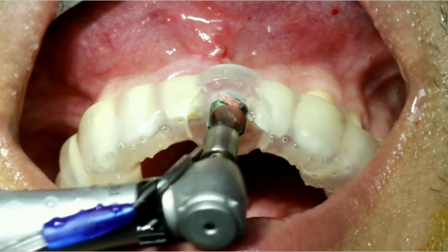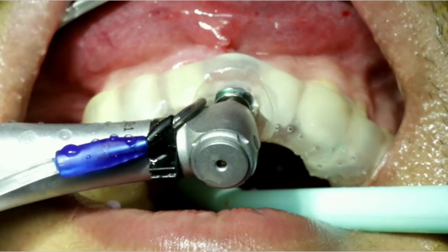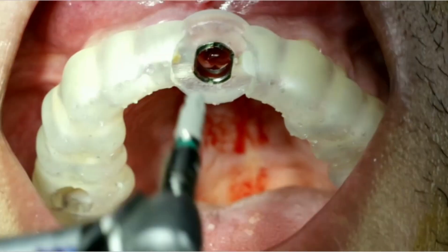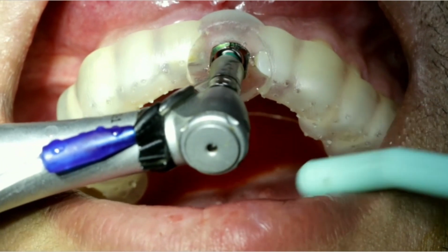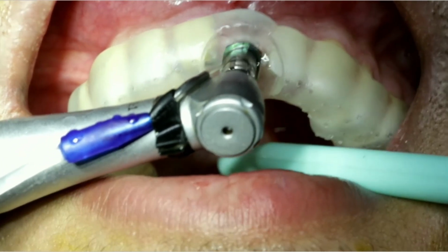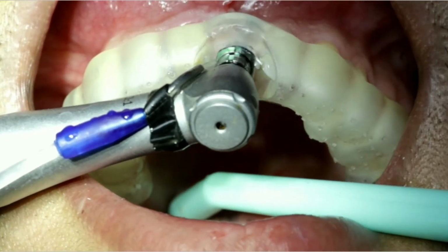Here is creation of the bed, and our osteotomy site is created exactly as we planned. Removal of the guide, the location of the site. Then here is the implant insertion through the guide. So we ensure the plan which we accomplished first is translated in the exact manner.